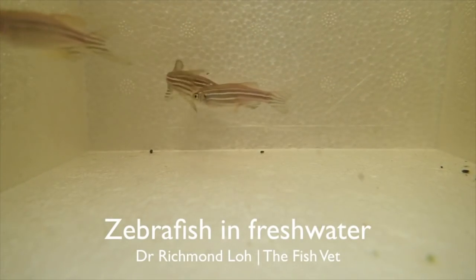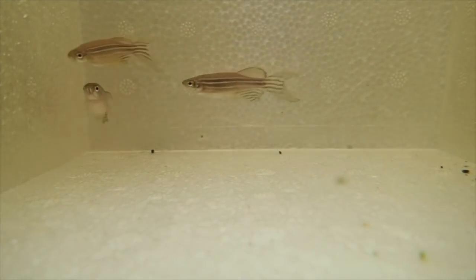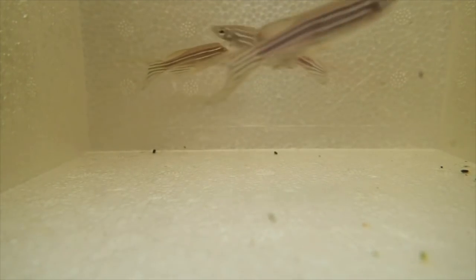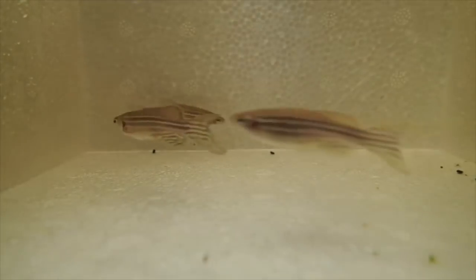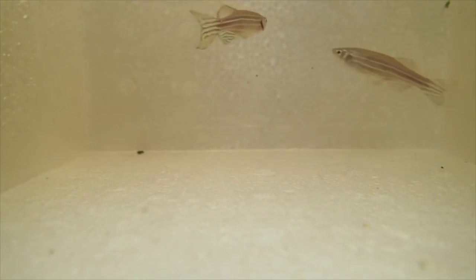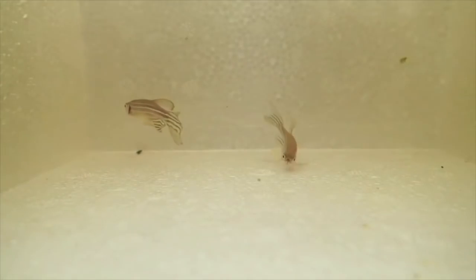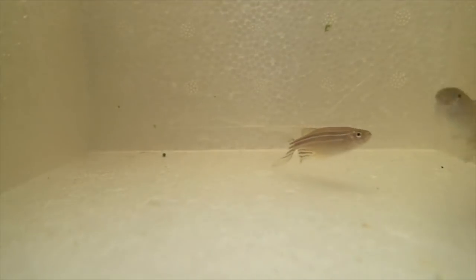In this video I'll be demonstrating five of the six stages of fish anesthesia. The sixth and final stage is of course respiratory and then cardiac arrest. Here I'm adding tricaine methanosulfonate, otherwise known as MS-222, at a rate of 100 milligrams per liter, and you'll notice that the fish has started to feel the effects of the anesthetic solution.